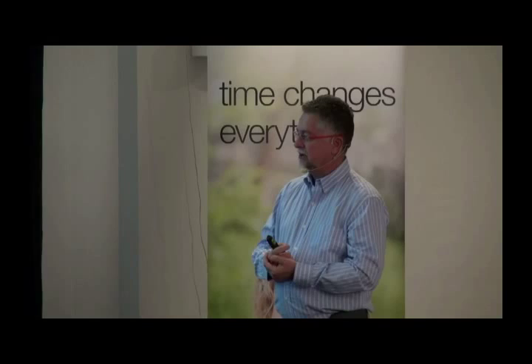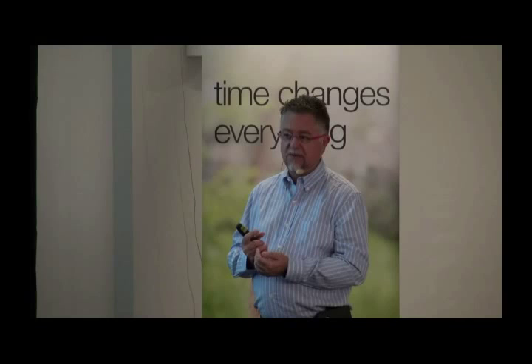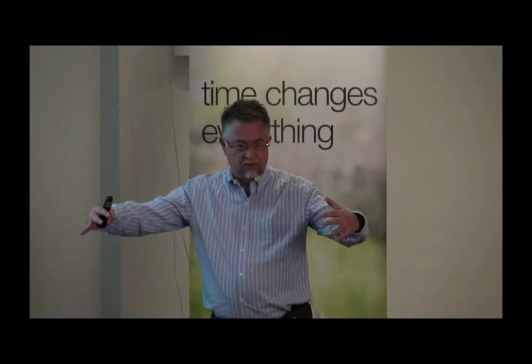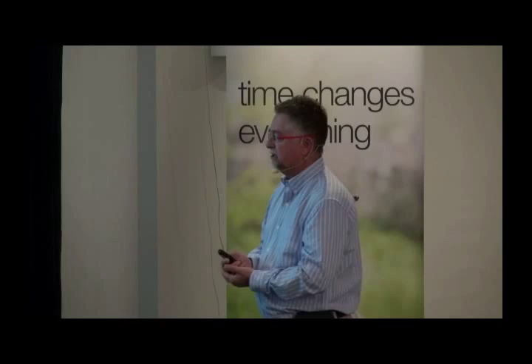And this instrument is really good, you guys, and to be honest, if you ask me, it's still the best instrument to look at platelets in Cavalier King Charles Spaniels, because remember, the Cavaliers have platelets that are the size of a three-year-old boy, all right? They have fewer platelets, but they're about this big. So this thing looks at platelet mass, and that's a nice packed platelet crit, and it's a really good way to look at functional platelet mass in the Cavaliers.